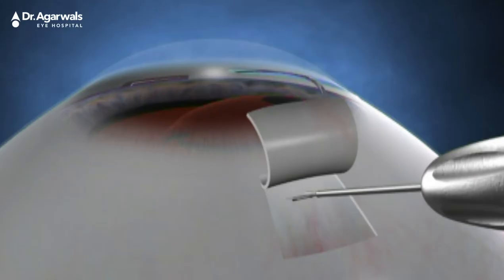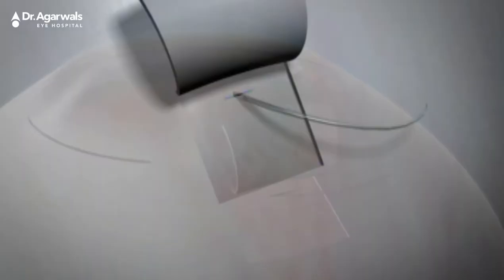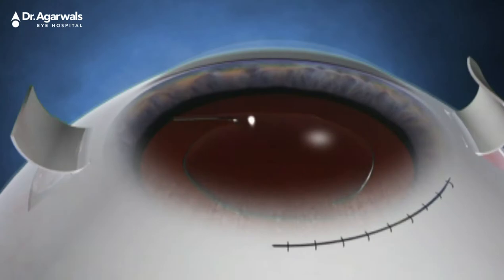We are here to describe a brand new technique: fibrin glue-assisted, sutureless intraocular lens implantation with sclerotuck of both haptics. We coined this term 'Glued IOL,' started by Professor Amar Agarwal in Chennai, South India, way back in the year 2007.